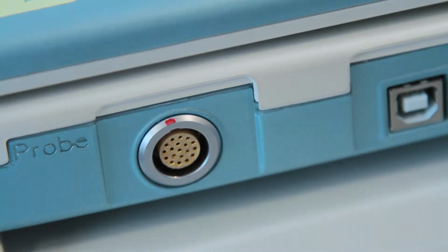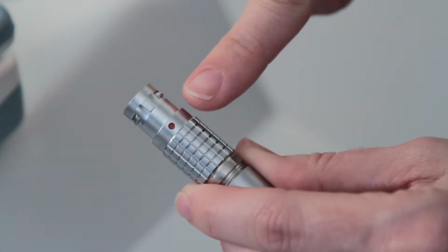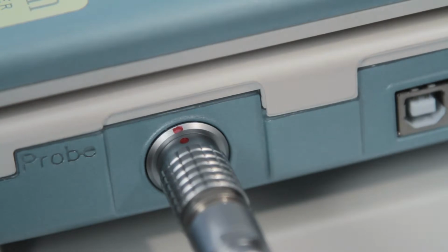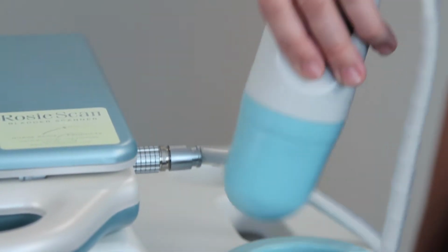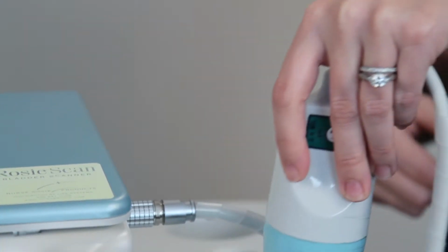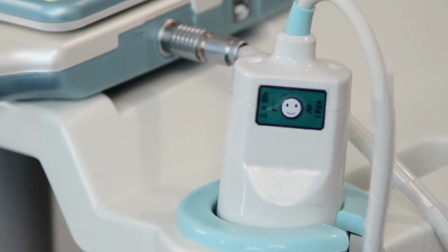You will see a red dot on the main unit port and on the plug at the end of the probe cord. Align the 2 red dots and then plug the probe into the main unit. It is important to not scratch the surface of the probe. This will result in inaccurate readings. Only the probe supplied by the original manufacturer may be used with this device.